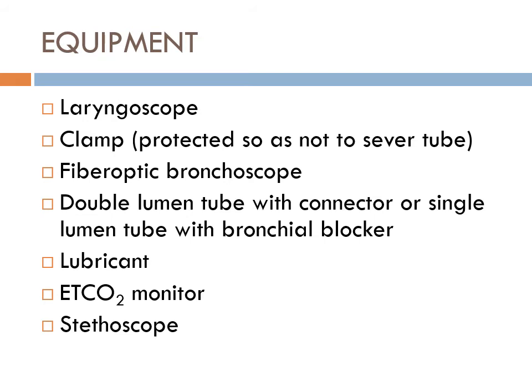And then air, which is orange in this case, because that's what I'm holding. Air, you take the bronchoscope out, right? You did the right thing, you took the bronchoscope out, you know where it is. You leave the bronchial blocker. The air is going to come in, some turbulence around here.